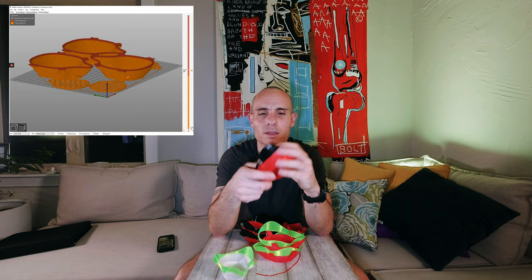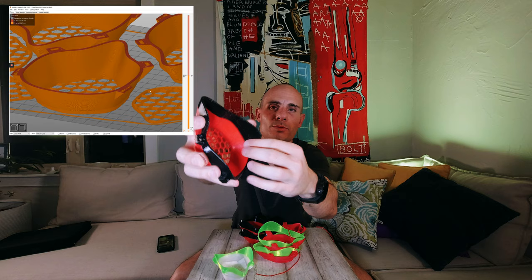So it's one solid piece and the difference is when I import it into Slicer, I set a layer height change so that the first 50-60% prints in PETG, as we usually do, and then the rest of the mask prints in super flexible TPU. The beautiful part of this is now this thing is extremely solid. These two pieces don't have any adhesion problems, they're not going to come apart, and there isn't going to be any really big microfissure or areas where the virus could potentially get in or air could get in and out, which is of course what we want here.